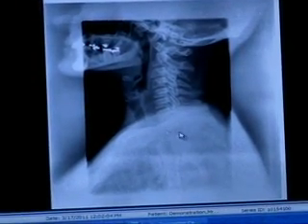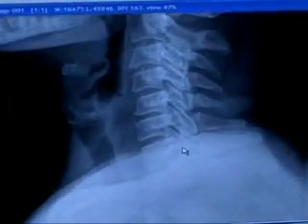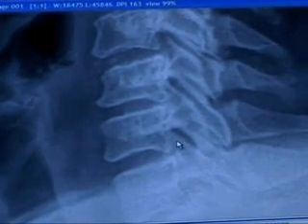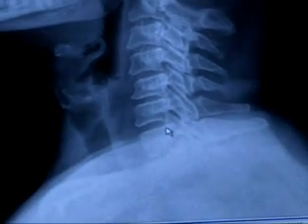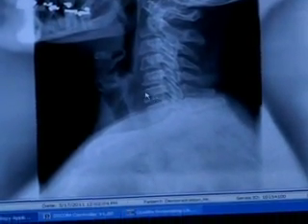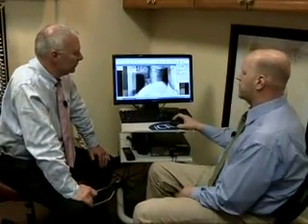So now, if we want to isolate certain parts of this cervical spine, we could actually just magnify it. And we could bring this all the way up to look at one segment if we want, which was impossible before, because before we'd have a plain film that we took and we were stuck with it. Developed it. If it came out incorrectly, then we'd have to bring the patient back in, re-x-ray it, redevelop it. That could sometimes take 2 visits. So right now, we can do this right away.